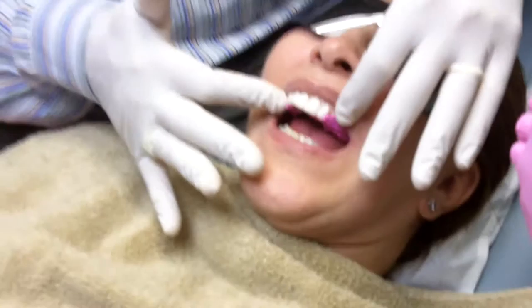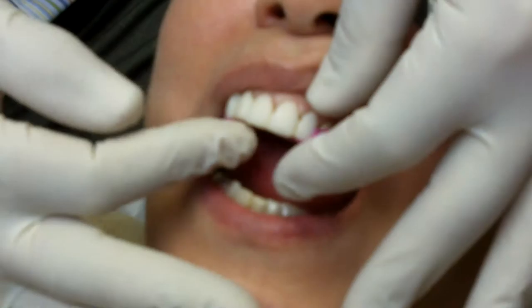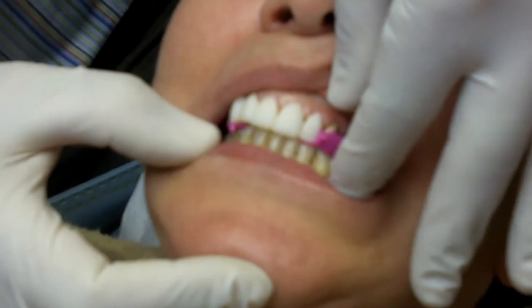We prepped a full upper arch, and for the bite registration, what I've done is separated five of her anterior teeth off of a full arch provisional. I decided I wanted to make a whole new provisional for her anyway, so I kept these five and put them in.